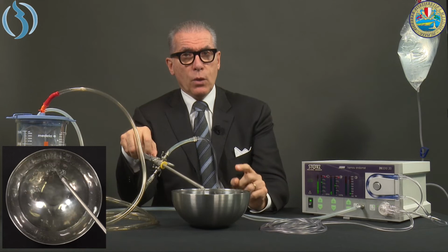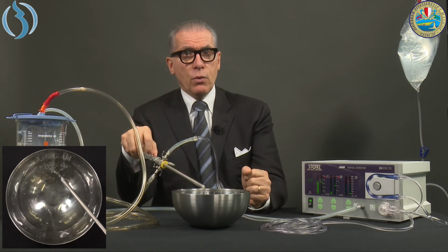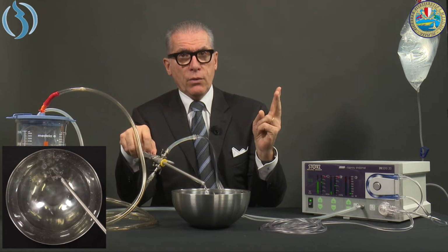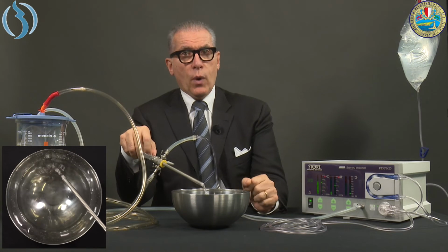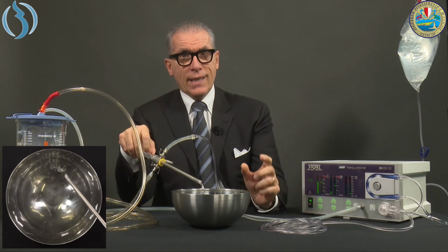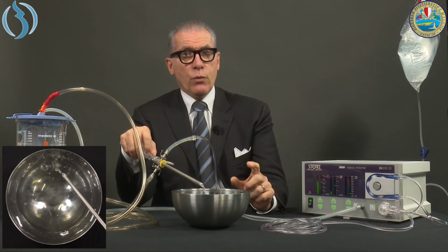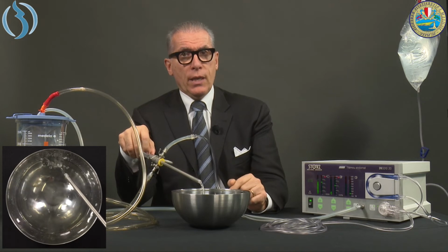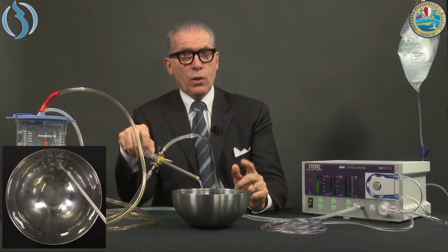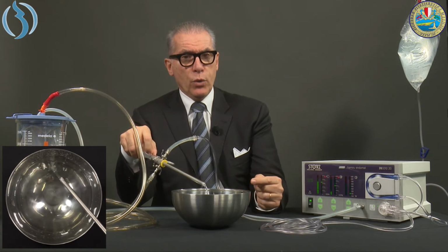And this happens also when you exchange the sac. In fact, I recommend you use the Y connector to keep one sac open and the other one closed. Once the used one is getting close to the end, but has not yet ended, you have to open the other one at the same time, and then close the previous one. Otherwise, some bubbles will remain in the circuit and will be moved into the uterus.